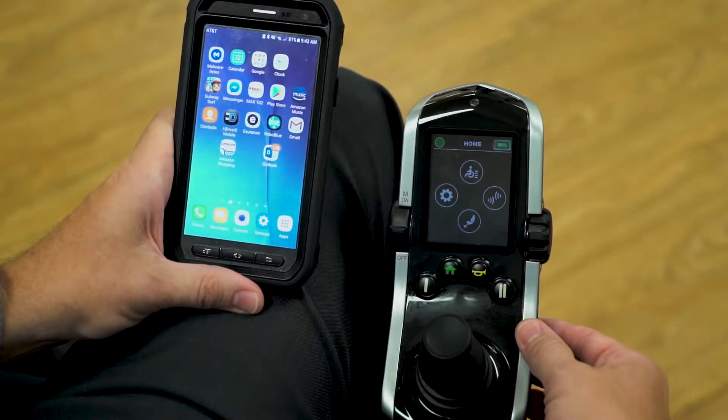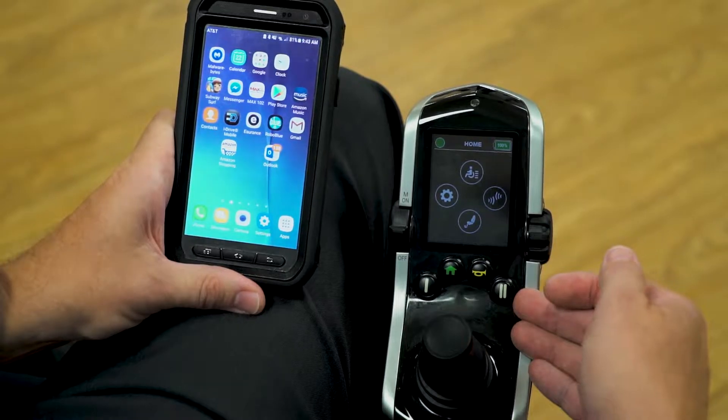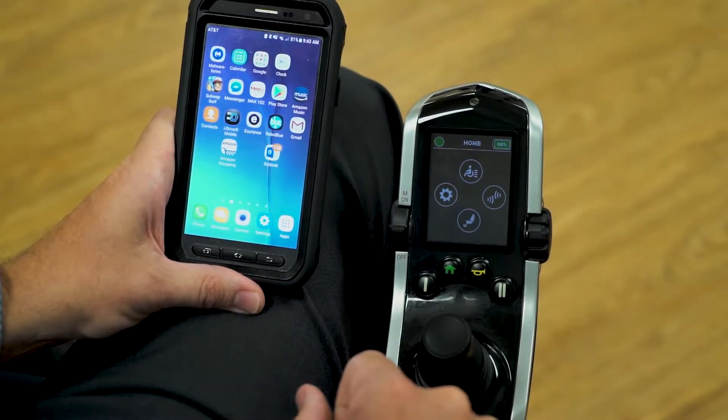In this video, we're going to show how to pair the Bluetooth chip in your Q-Logic 3 expandable electronics to an Android type device.